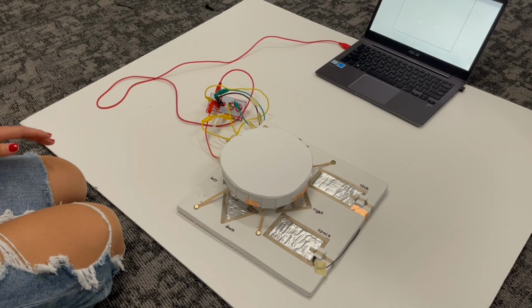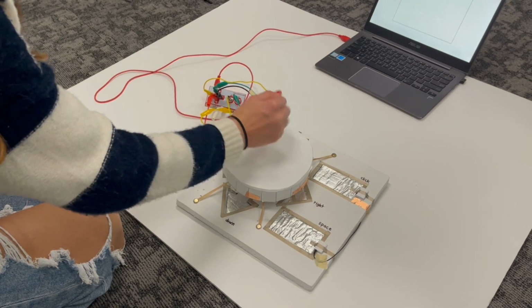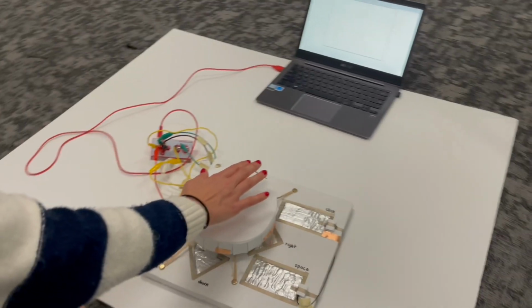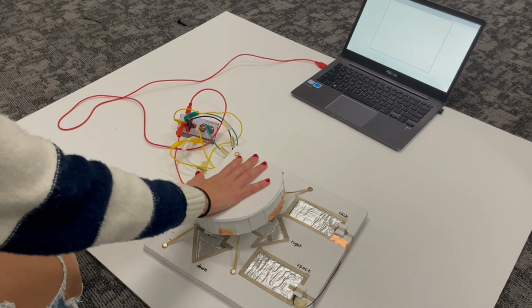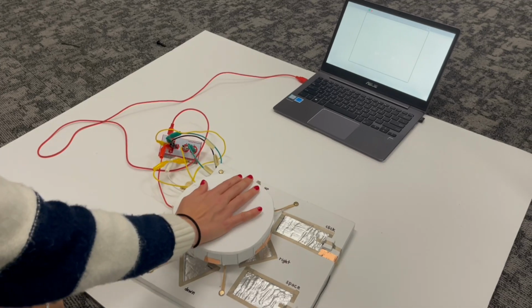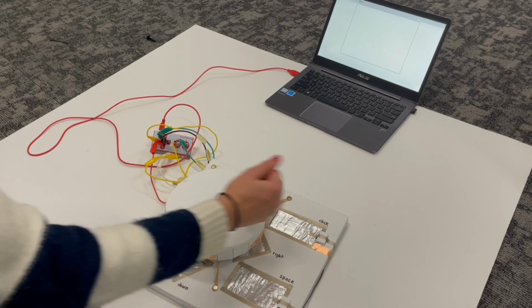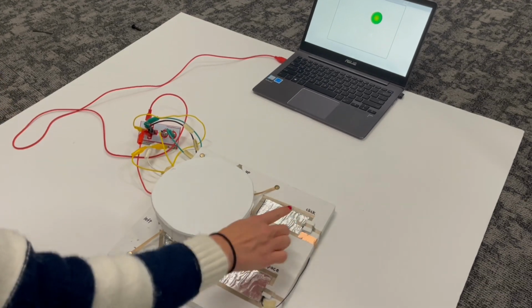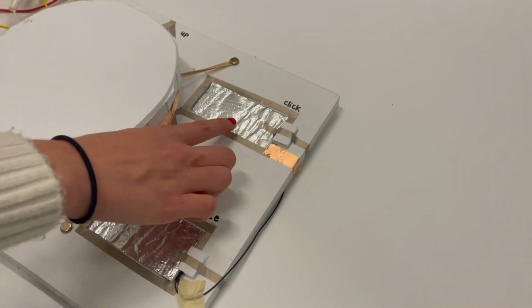So with the Diplegia add-on, you can use your hand like this, or your hand like this, or whatever's most comfortable. And just to show that it works, here's the left click, up, down, right, and then go like that, or like that. Just make sure that you're touching the ground and the arrow key at the same time.